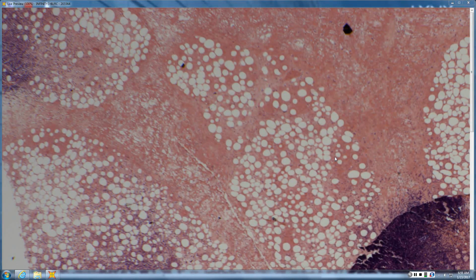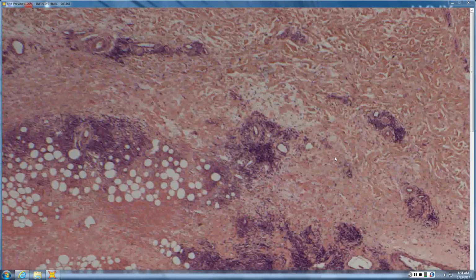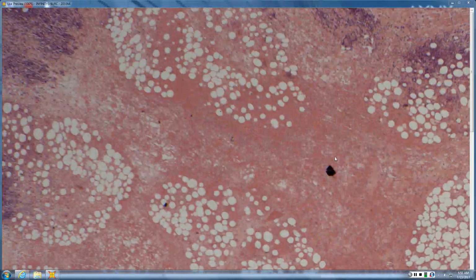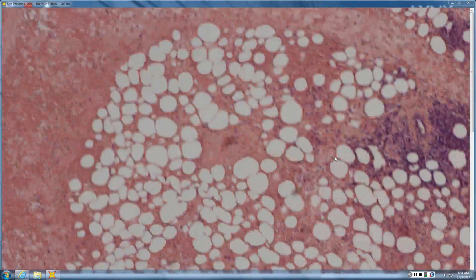Another clue at scan is this hyalinization. See all the pink hyalinized change you see there. Another clue in this entity, which is not really great in this example, is that you can get lymphoid follicles. So this is lupus, right? You can see this person has superficial and deep lymphocytic infiltrate at scan, and lupus is in the differential for that. Ideally, you'd want to see some interface change even at higher power at the DEJ, unless it was tumid lupus. But we have a lobular panniculitis, lymphohistiocytic, with hyalinization, and those are all clues, but the fact that you have lupus overlying it is really helpful. A lot of times in lupus, if you go on higher power, you will have plasma cells. They're not required, but you do tend to get a plasma cell infiltrate. Here you can really see the hyalinization a lot better.